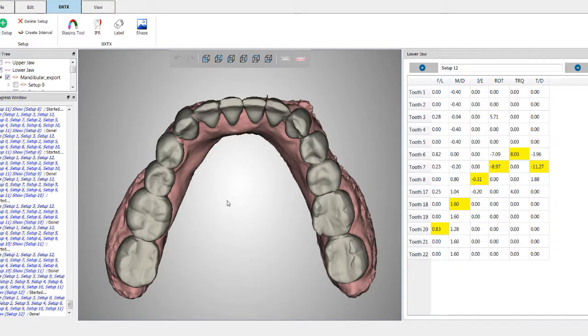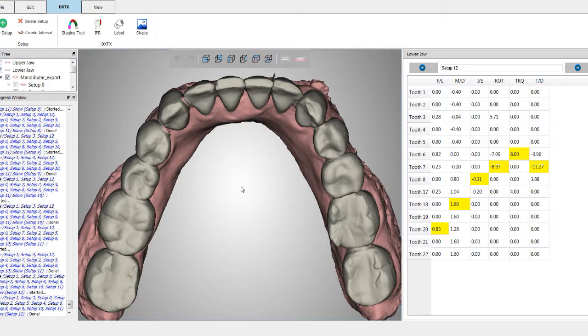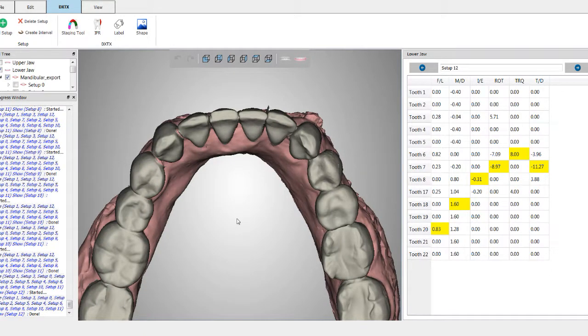Okay. Now, just a little clinical tip here: as my patient is progressing through the aligners, when the patient is there for their checkup, and I see my patients roughly every 2 months, I give them roughly 4 aligners at a time. When they come in, I like to have the floss there at the chair and just run floss in between the contacts where I know I'm moving the teeth.